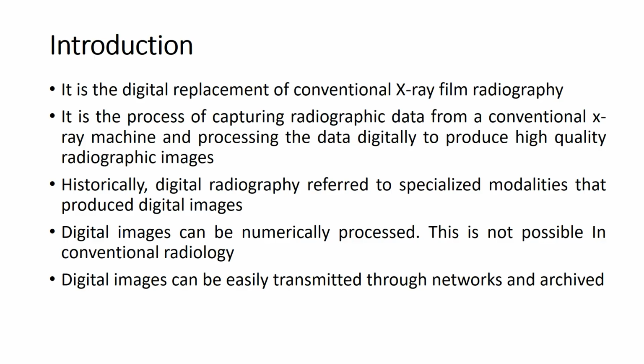Actually, digital radiography is the digital replacement of conventional X-ray film radiography. That means it removes the conventional X-ray film processing. In this process, we capture the radiographic data from the conventional X-ray machine and process the data digitally to produce a high quality radiographic image.